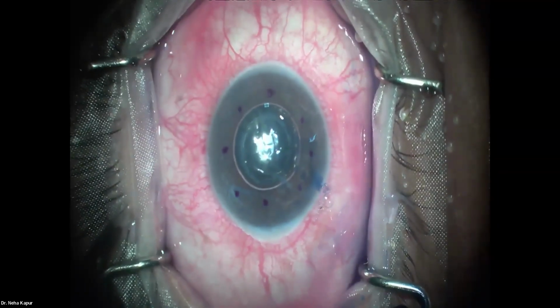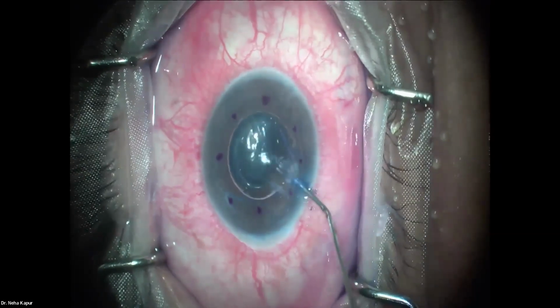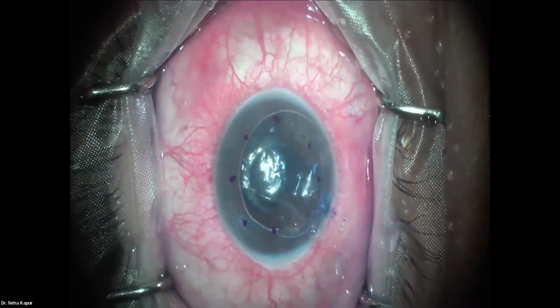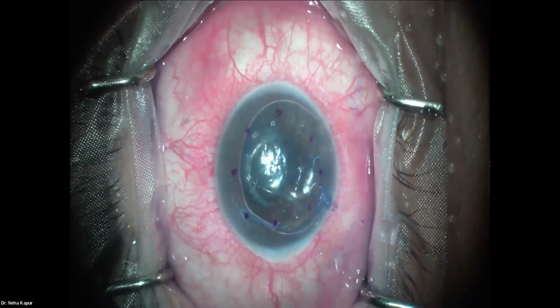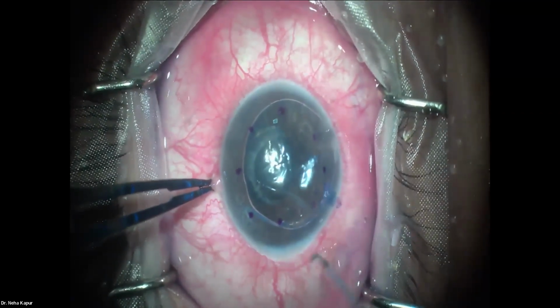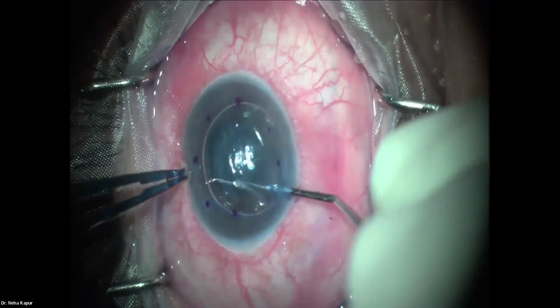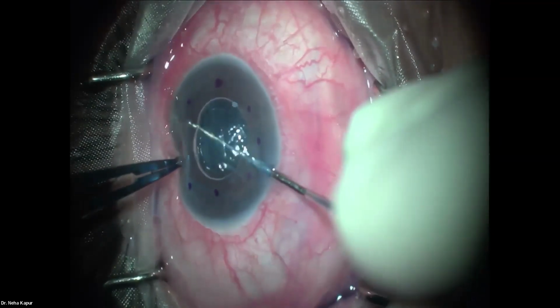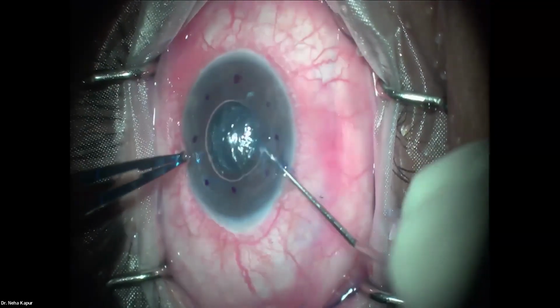And this is what we were earlier talking about, that sometimes you will have frequent issues with the air coming out and collapse of the chamber, but it's okay to keep forming it back. You can see the DM coming out.